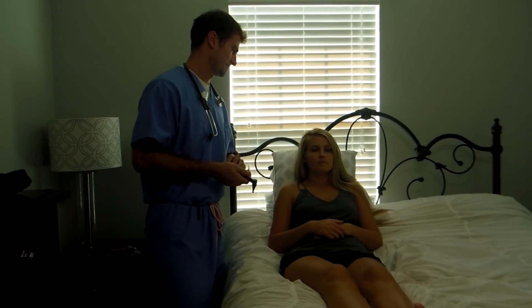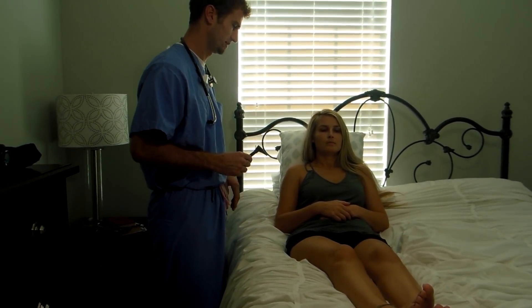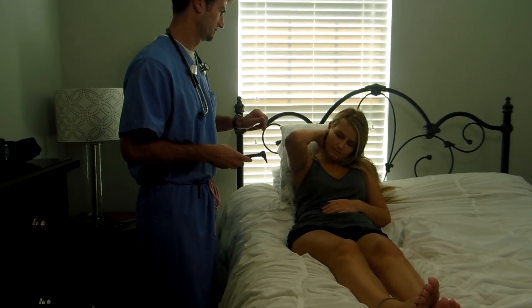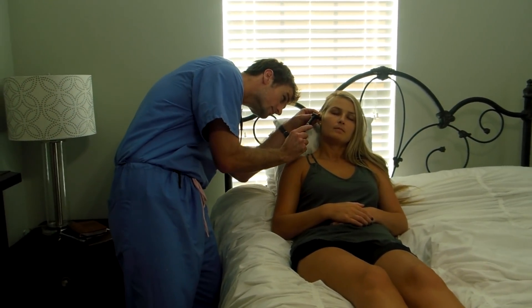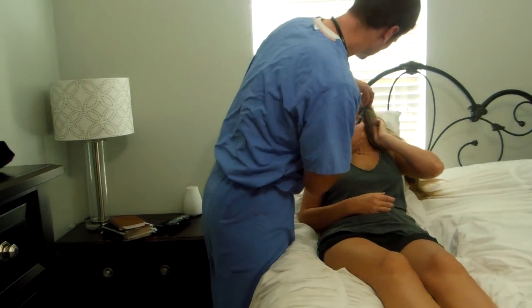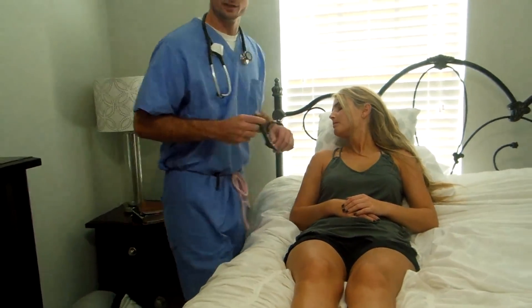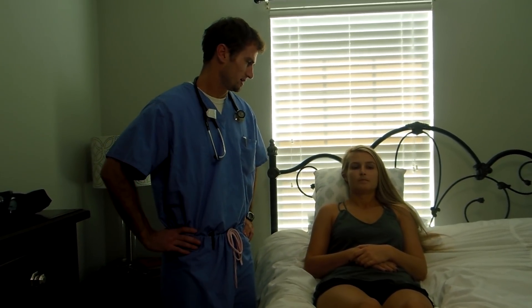So now I'm going to move on to your ear examination. I'm going to have to insert this into your ear just a little way — I'm not going to hurt you. Can I pull back your hair? We'll lift up and back on your ear and look at your tympanic membrane. Her ears look good. There's no redness or drainage in her ears. Her tympanic membrane is a pearly gray color, which is normal. She also has a positive light reflex in both ears.